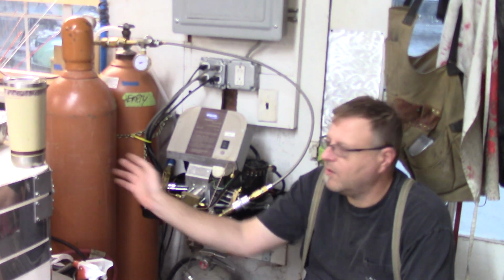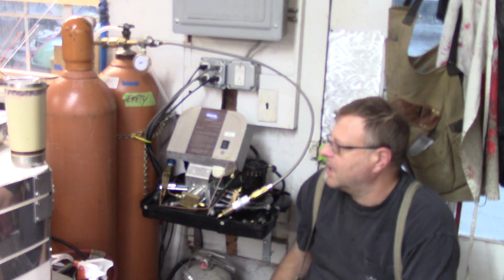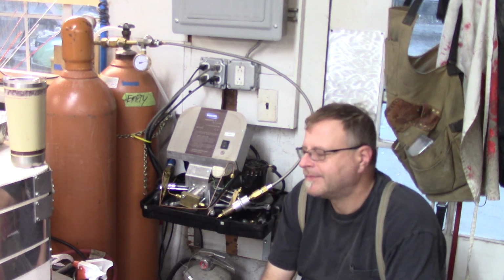So to fill one of these bottles from scratch is about 36 hours to 2,000 psi. I was also warned, don't run it to 2,000 psi because you'll blow the seals out. Well, imagine that. I blew the seals out.